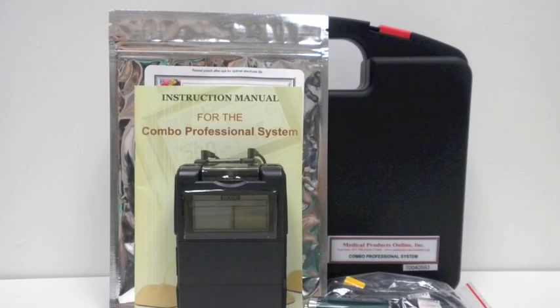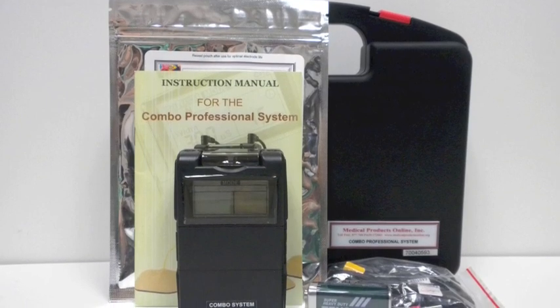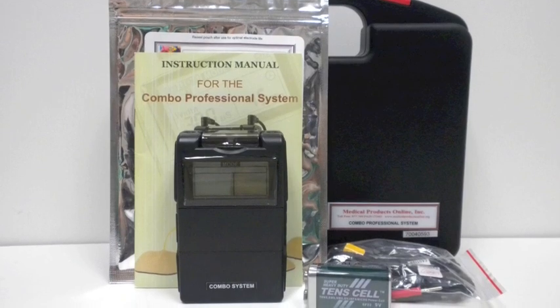You'll notice that your device comes with everything that you need to get started: an instruction manual, the electrodes, lead wires, and the device itself, as well as a 9-volt battery.